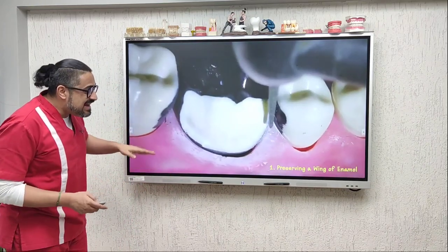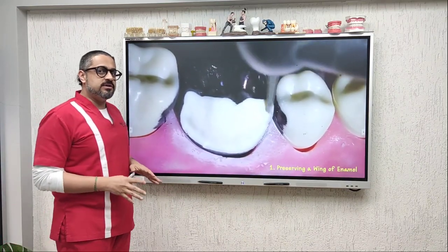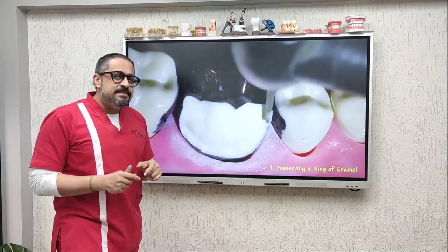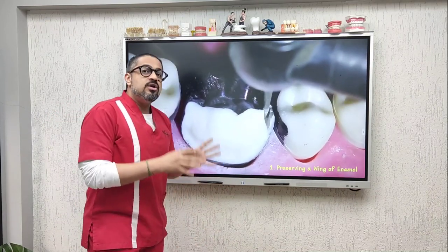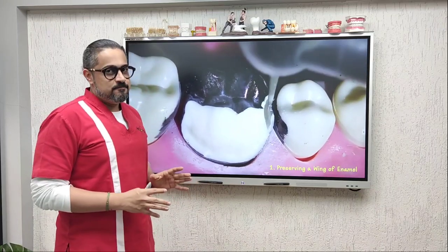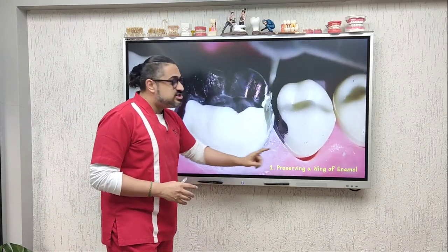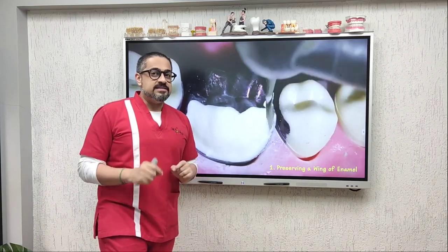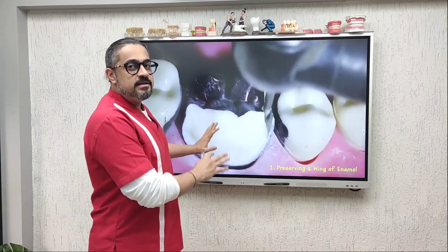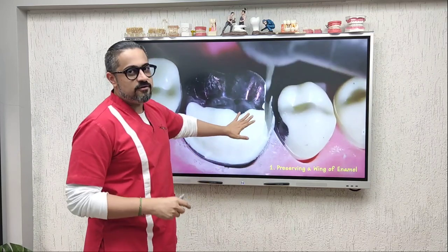Let's look at the first example. When preparing the contact area of a tooth, it helps to run your air rotor such that you leave behind a thin ring, lip, or wing of enamel. This will ensure that your adjacent tooth does not get traumatized whilst you are preparing the proximal surface of your tooth.